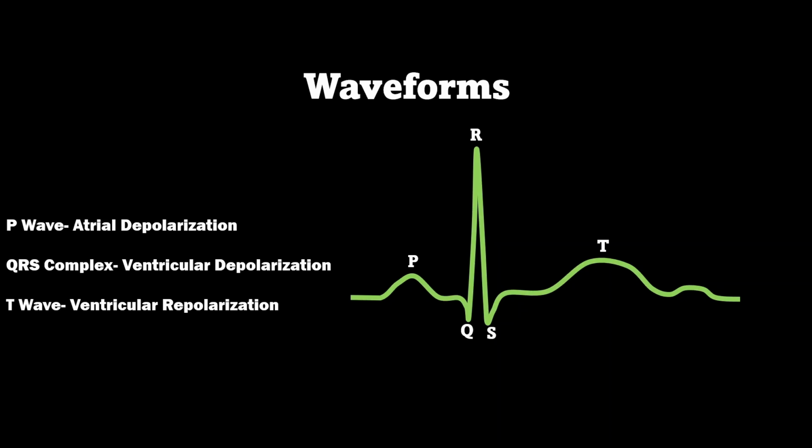You might wonder why there isn't any atrial repolarization shown on the EKG beat. You can occasionally see it, but it's usually buried inside of the QRS complex. And finally, we have a U wave, which is thought to be delayed repolarization of our Purkinje fibers. When you have a very prominent U wave, it can suggest something like hypokalemia, which means low potassium in our blood.